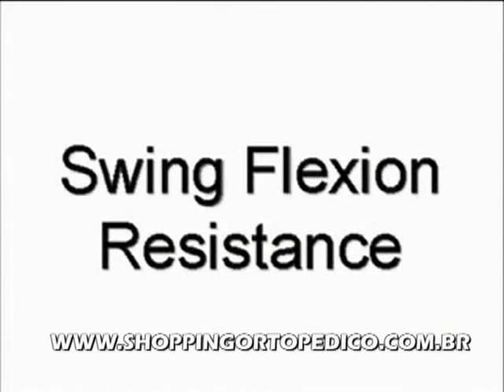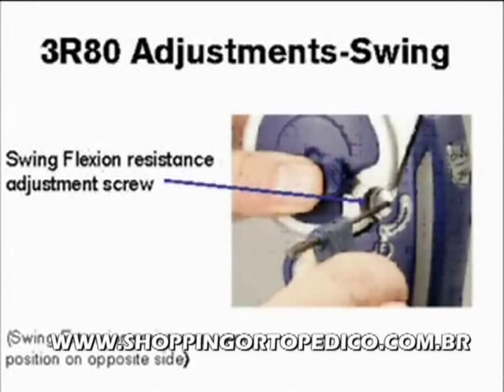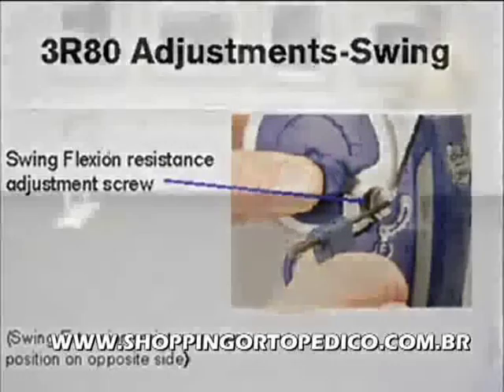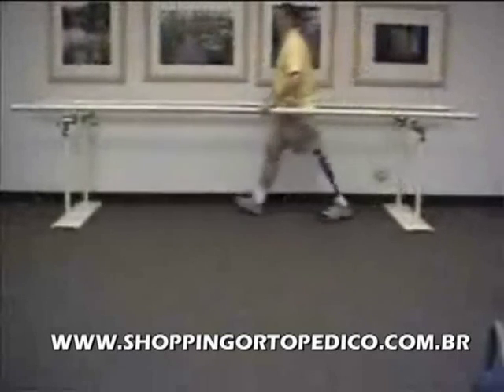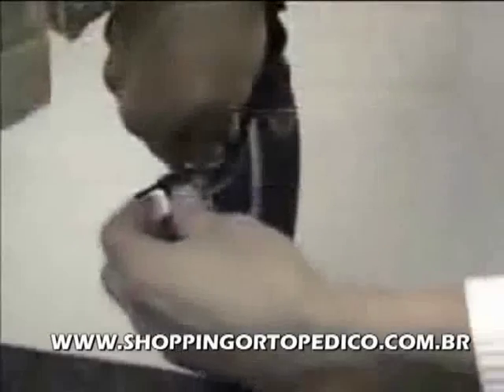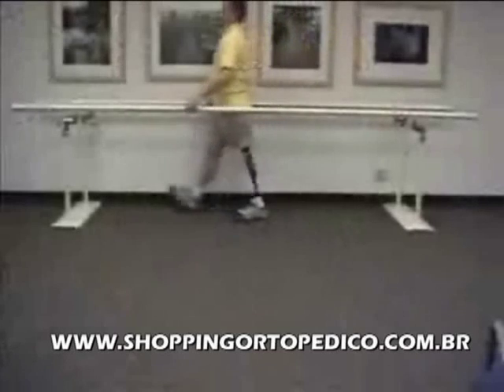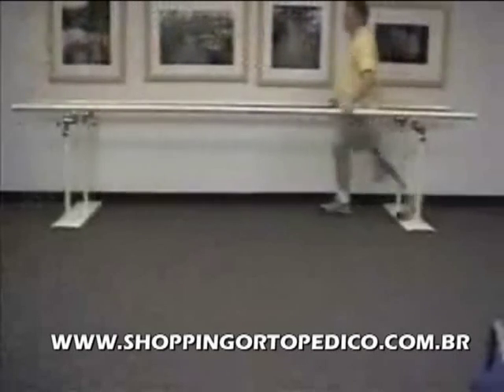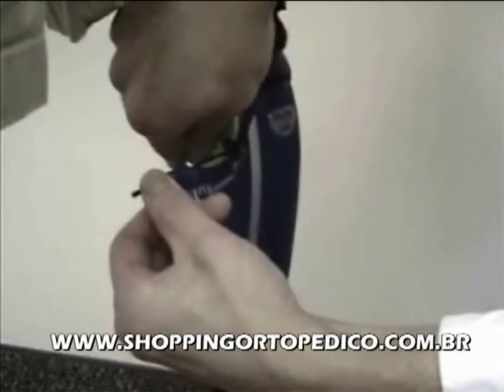The next adjustment is the swing flexion resistance. The swing phase adjustments are found on either side of the knee under the small blue caps. When the swing flexion is properly adjusted, the patient should feel a smooth flexion movement of the knee without an abrupt stop at their self-selected walking speed. If they feel that they are waiting for the foot to come forward, or if you observe excessive heel rise, increase the swing flexion resistance by turning the flexion valve screw to the right. This will decrease the heel rise. If the heel rise is too low, or if the patient feels an abrupt stop at the knee during flexion, turn the flexion valve screw to the left in order to increase the heel rise.